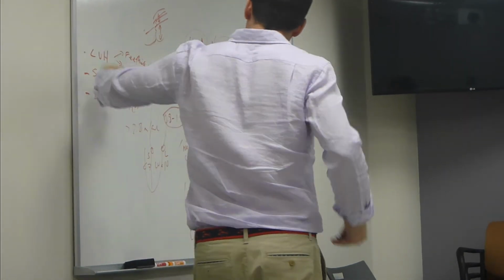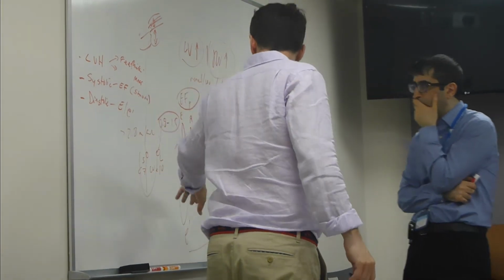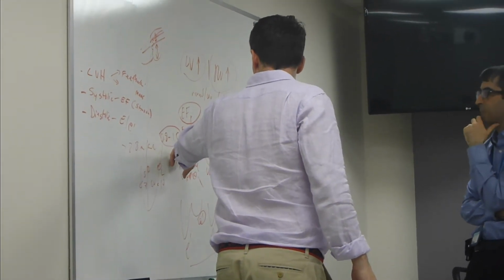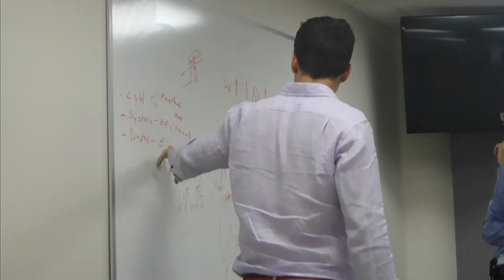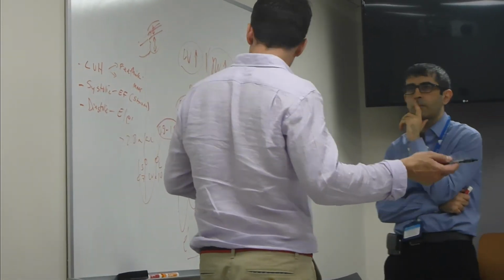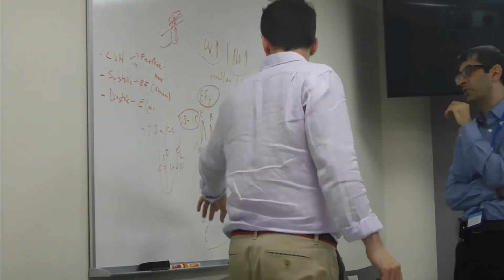And then it seems like by doing the combination of tissue Doppler and mitral inflow velocity, we'd be able to get a sense of their diastolic dysfunction by looking at the already established parameters. I think by the literature that we were looking at, it was 8, but you're saying the new guidelines said 7 centimeters per second for the septal.